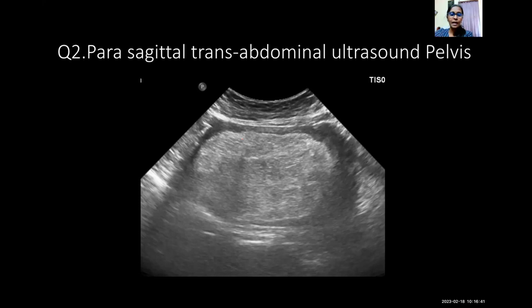All right. I think that was also what our preliminary ultrasound was like. It's a bit lobulated. We had two classical cases, now I'll fine tune to this lesion. You saw that it's echogenic. So with echogenic, one of the differentials would be a fat-containing lesion. I agree with you. Some fluid can also have a solid-looking or echogenic appearance. We have to keep that in mind. We can look for through transmission to help us out with those that appear like solid.